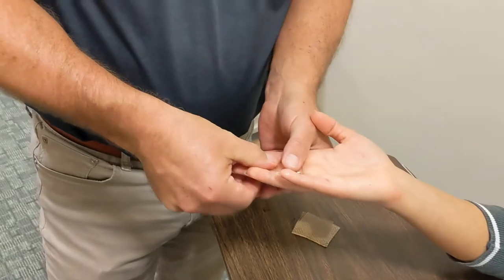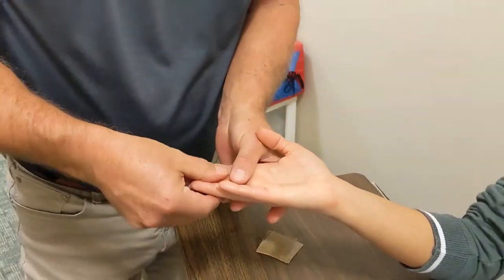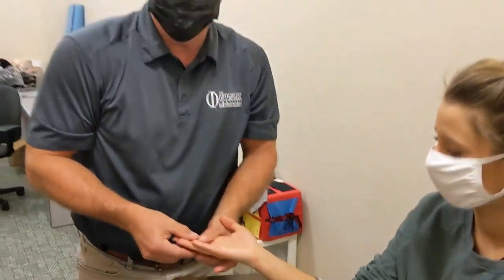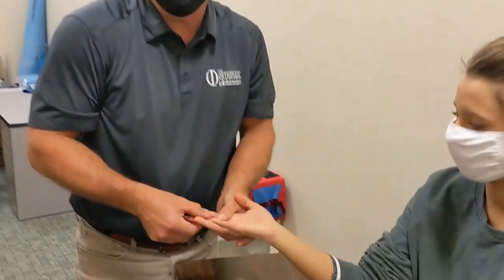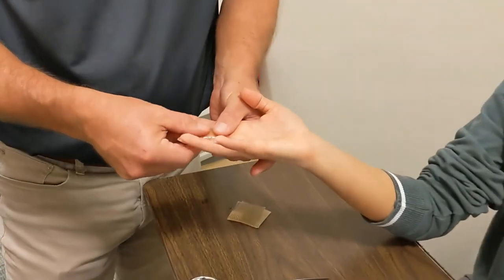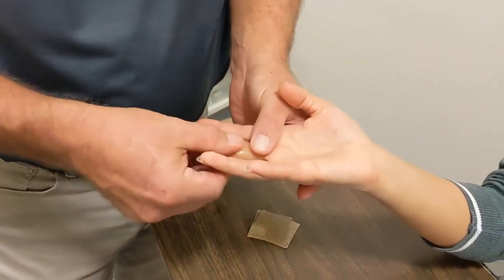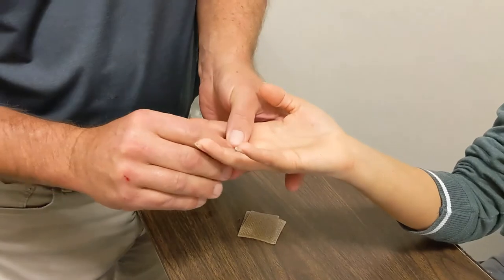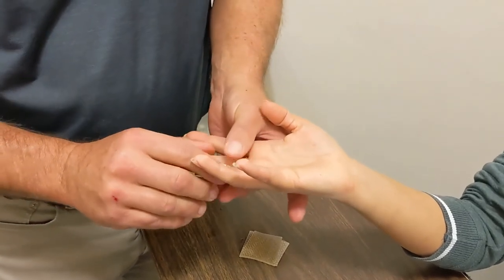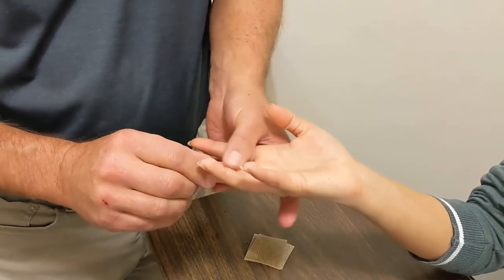It takes about two to three minutes to harden. And when it's done, it'll be a nice custom fitted splint that actually has a lot of rigidity and can provide a lot of protection for a fracture or some other injury, like maybe a ligamentous injury.